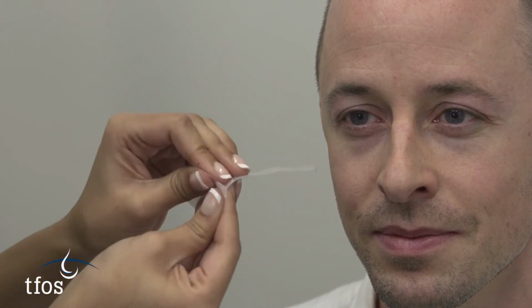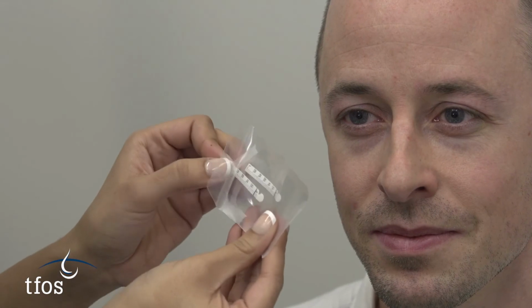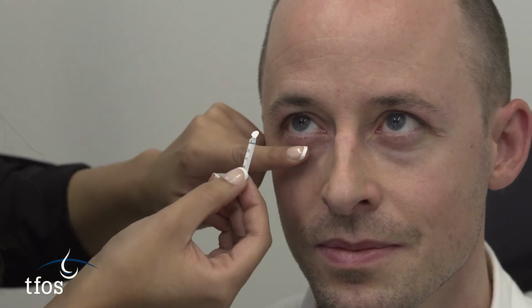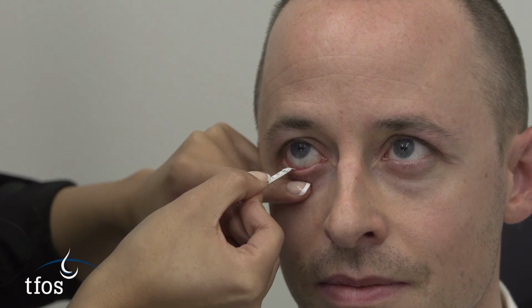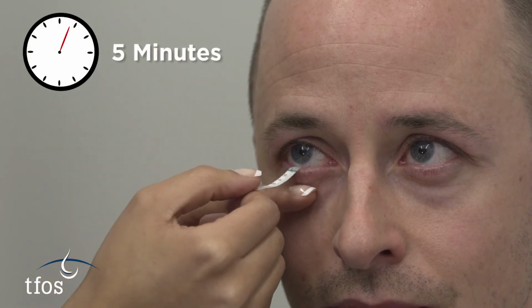The main role of the Schirmer test is as a provocative test of reflex tearing to determine lacrimal gland function, and therefore should be performed without topical anaesthesia. Bending the strip at the notch, ideally without touching the filter paper strip and contaminating it with skin oils, the hooked end is placed over the lower lid margin. Placement is ideally within the temporal third of the lid margin. The strip is left in place for 5 minutes and the wetted length measured from the notch after this time.